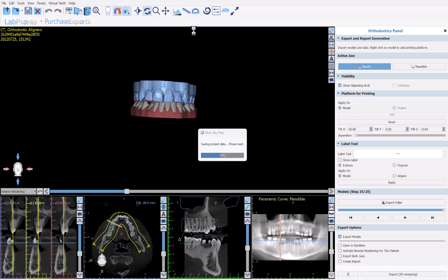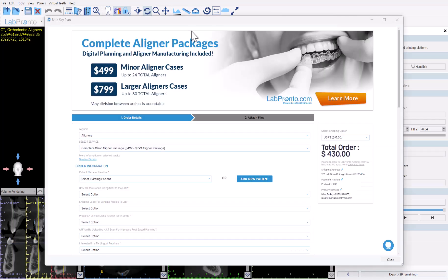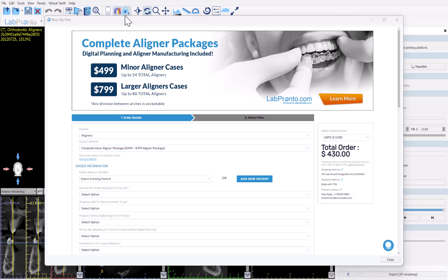If you click yes, the software saves the case. If you haven't named it yet, it will prompt you to provide a name and choose a save location. It will then attach the case to your order form for aligner fabrication. The aligner order form opens showing pricing: $499 for up to 24 total aligners and $799 for up to 80 total aligners.